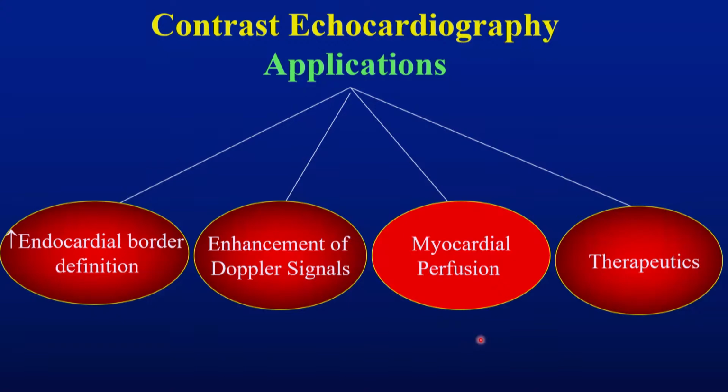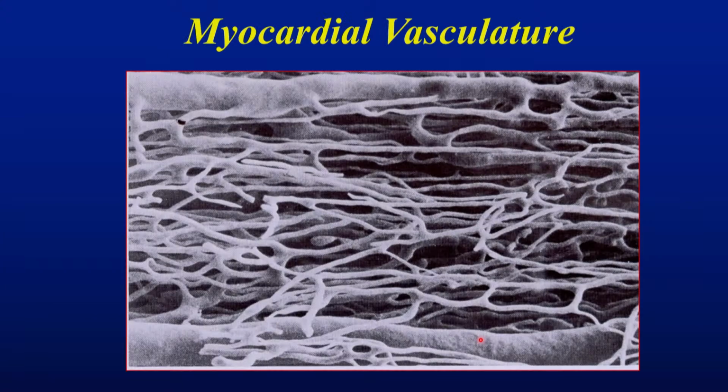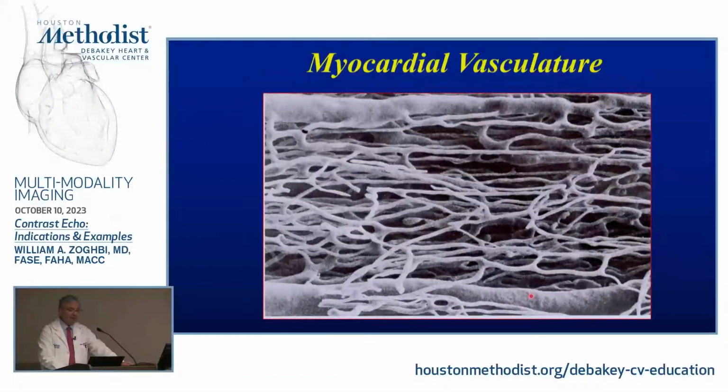That's pretty bad. All right, enhancement of Doppler signals we talked about. Just a few things here. Let's see, what time is it? Okay. Few things for you, because I think this is a science for many, many years, and I know you're not exposed to it, but I think you need to know that. If you think about velocities of blood in the chambers and in the arteries, what's the usual velocity like? Centimeters per second, right? From 20, 30, 40, 50, 60, 70, 100, right? Aortic stenosis, more and more, right?